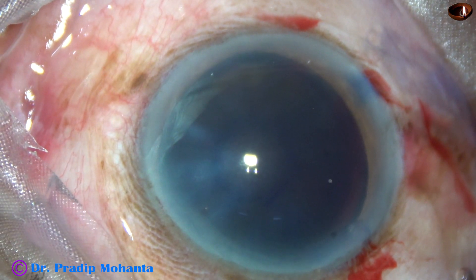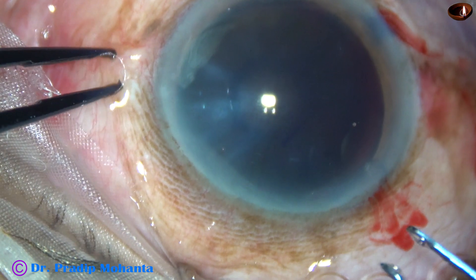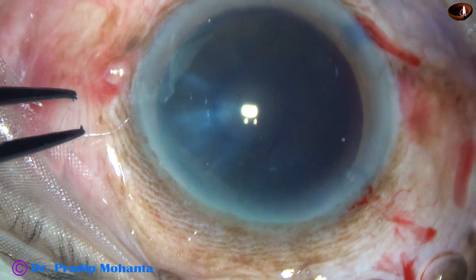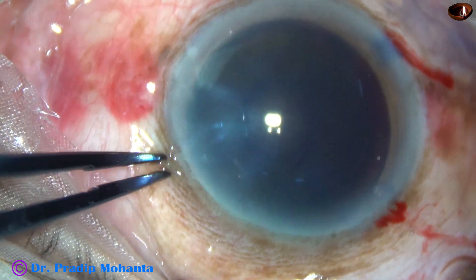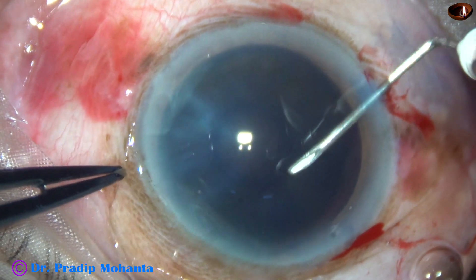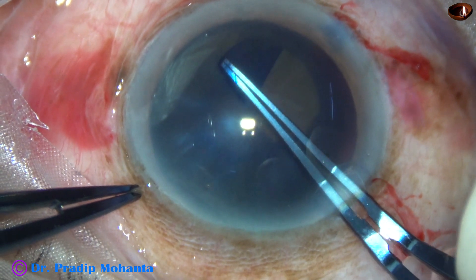Now capsulorrhexis. As I go in with the utrata forceps and try to tear the anterior capsule at the central part, I cannot do it — the whole lens moves and I cannot pierce the anterior capsule. This means there is some generalized weakness of the zonules. So I take a needle, raise a capsular tag, and very gently go all around to do a large rhexis.